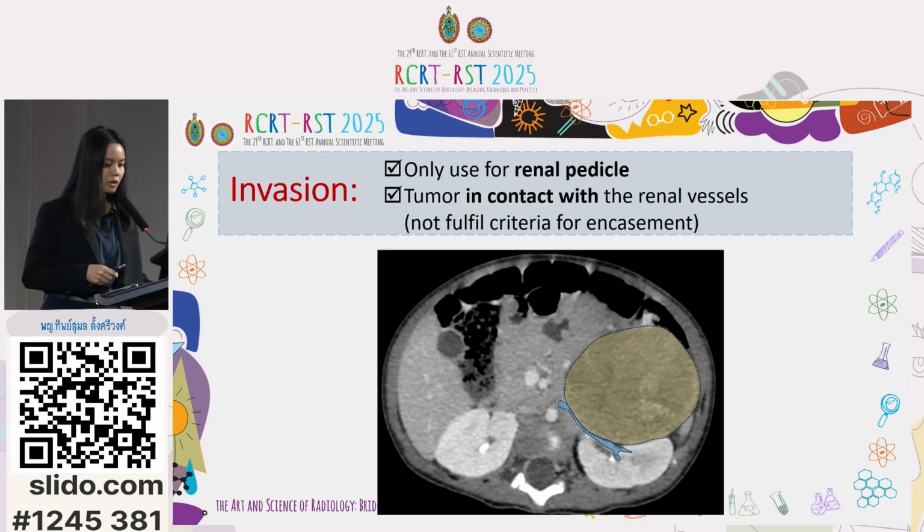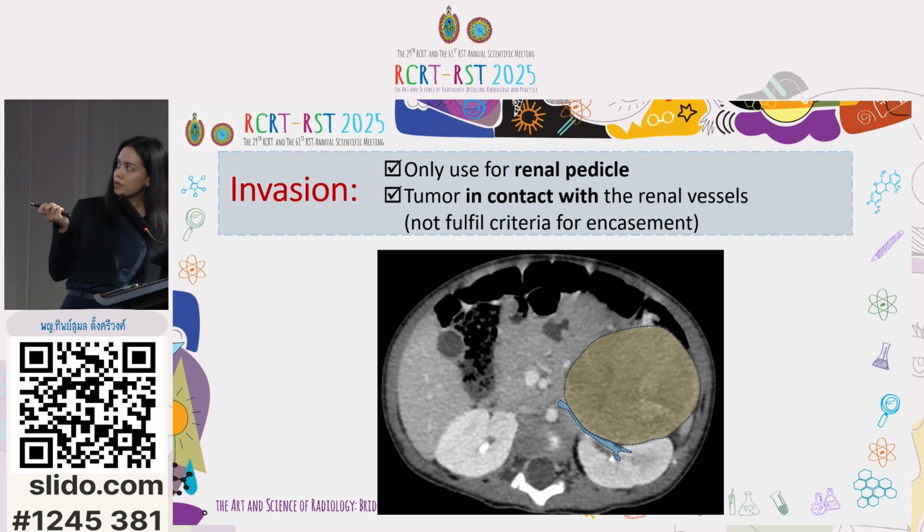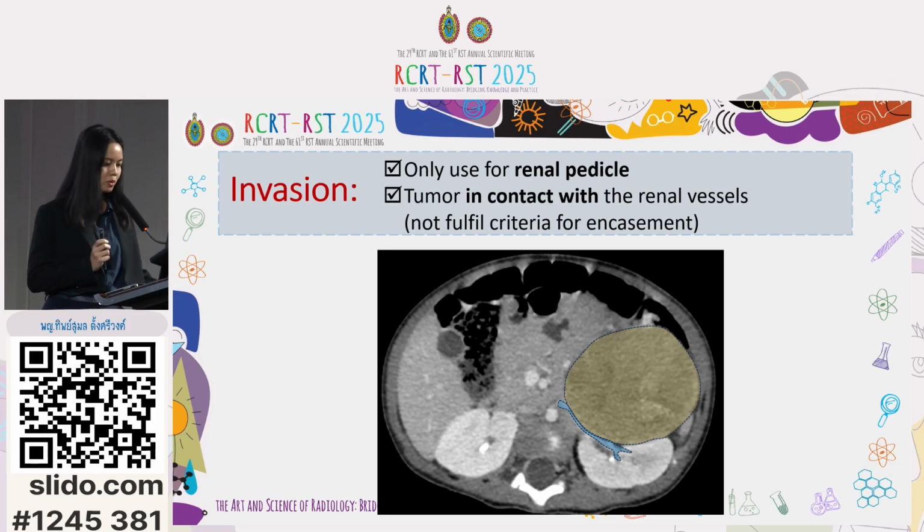The last term I'd like to cover is invasion, which applies only to the renal pedicle. This is a left suprarenal tumor in contact with the left renal vein, even though it doesn't meet the criteria for encasement.